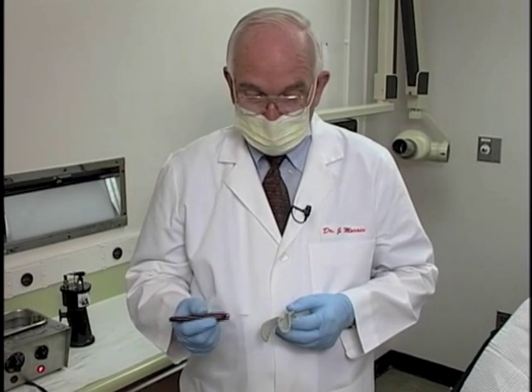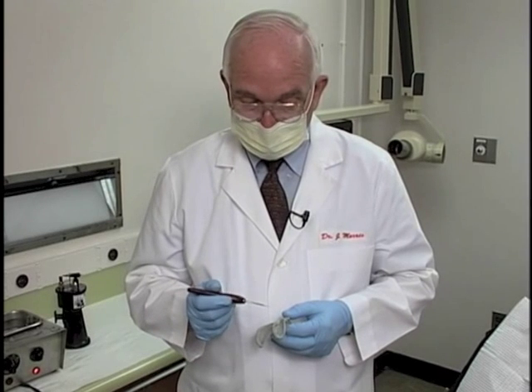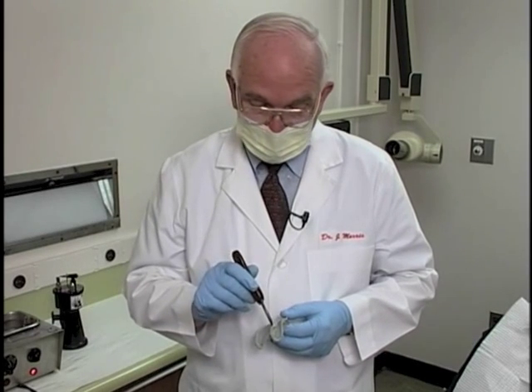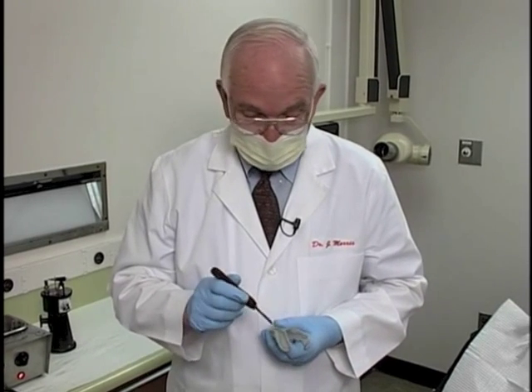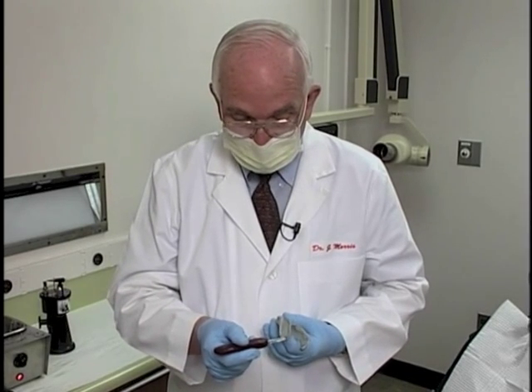Now what we need to do is to trim from the inside of the tray any extraneous material which might produce a pressure spot on the final impression. As an example, on the retromolar pad and on this lingual surface through here, and somewhat a little bit of this facial surface here, and the same on the other side. A little bit on this lingual surface here and the retromolar pad area.